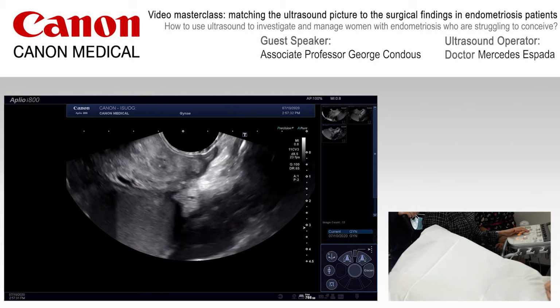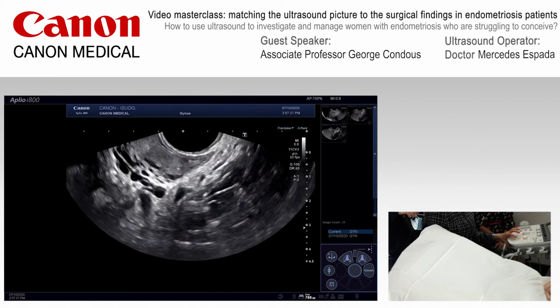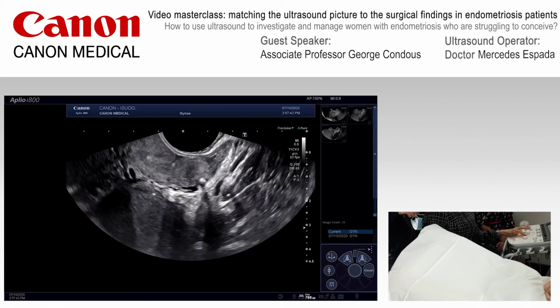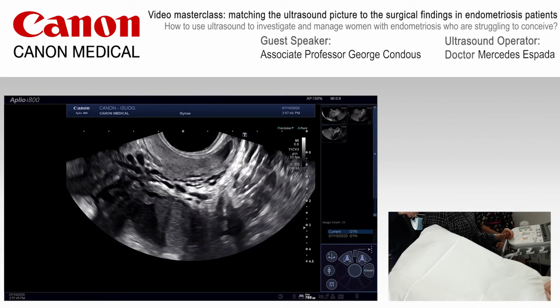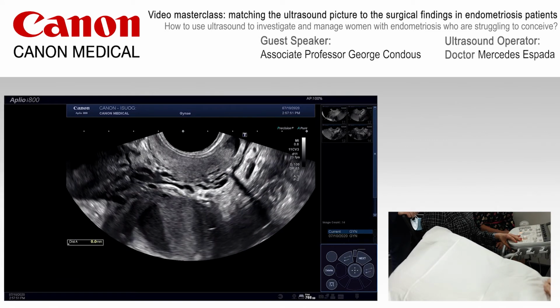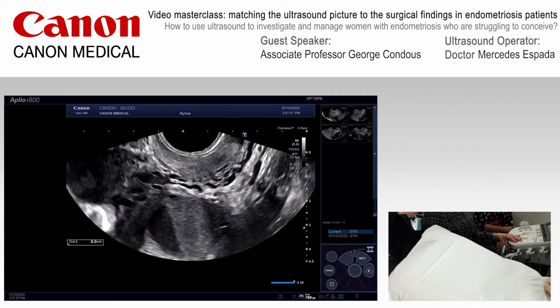The ovary is fixed to that. The bowel is also fixed to the vagina, fixed to the cervix, fixed to the torus uterinus itself. And we know that this fixation is preferentially midline and to the left of center. So we're already starting in our minds to construct a view as to what this may well look like at laparoscopy, and bringing together the technologies of advanced endometriosis ultrasonographic skills and complementing those with the ability to perform high-level laparoscopic surgery is a perfect blend, a perfect mix. So there's such complementary modalities.